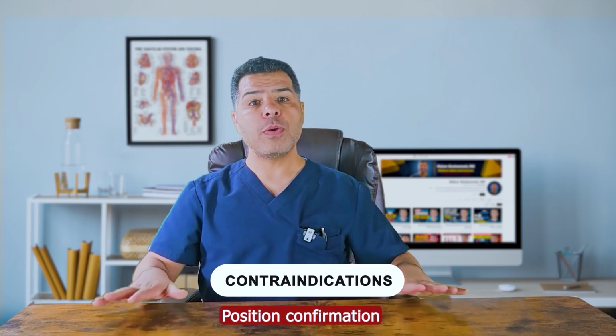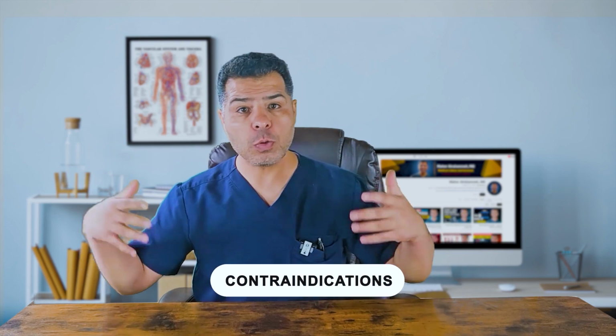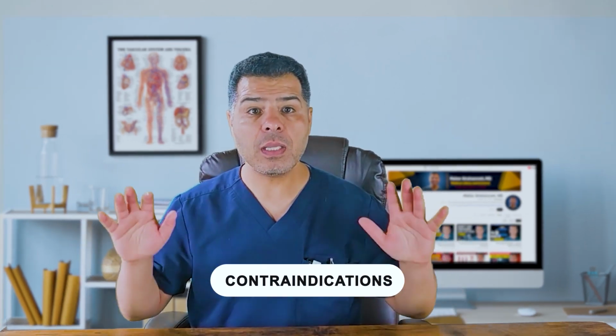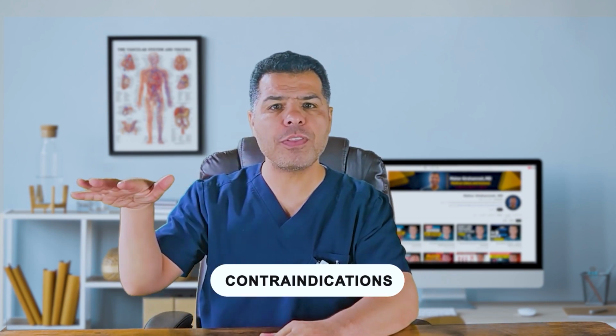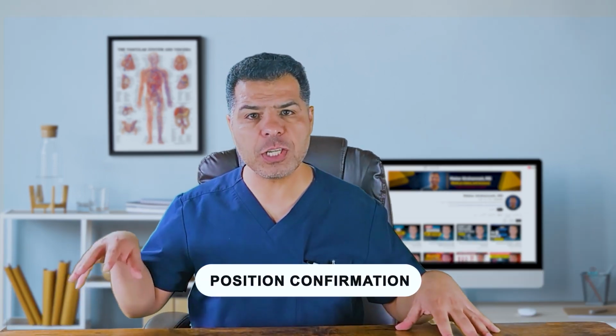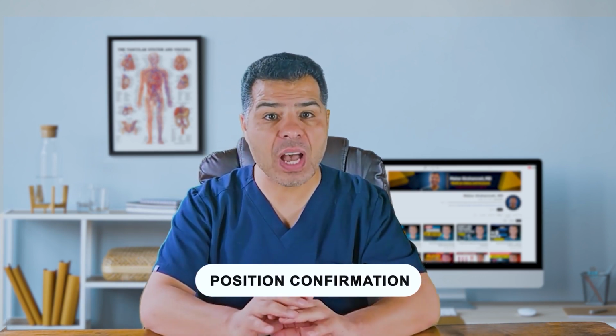We must confirm the proper positioning of the PICC line, a peripherally inserted central line, or centrally inserted non-tunneled catheters before using them. The tip of the catheter should be at the atriocaval junction at the level of the carina. Post-placement chest X-ray is the gold standard here. Now, some PICC line insertion technology confirm the proper position using ECG guidance with high accuracy.